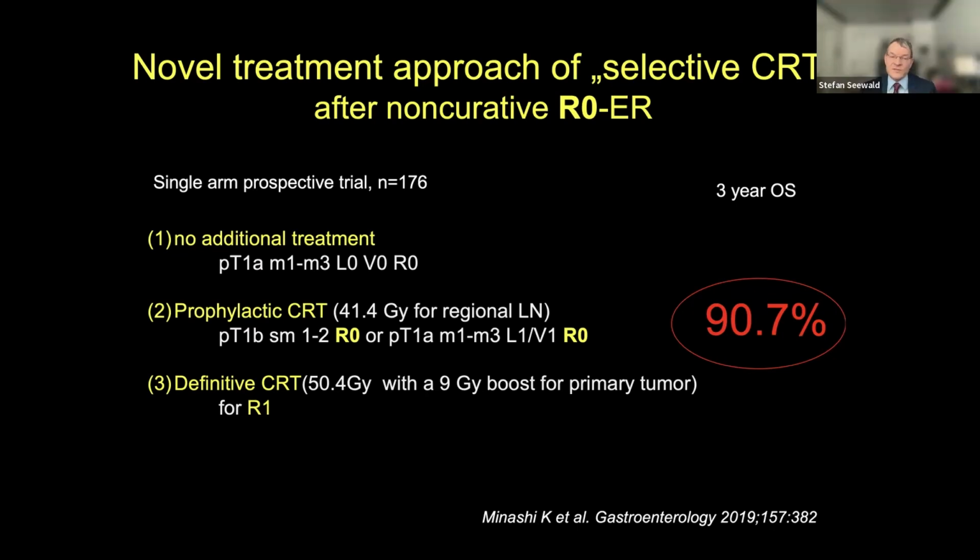Thank you for this very important question. I brought this issue up because I know you in Ukraine also have a lot of endoscopists performing ESD well. We can perform circumferential ESD today, but we also have to think of the future of the patient with regard to stenosis. The problem of stenosis is still unsolved. So you have several options.